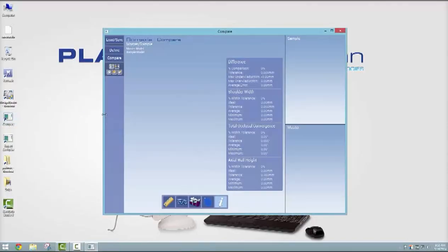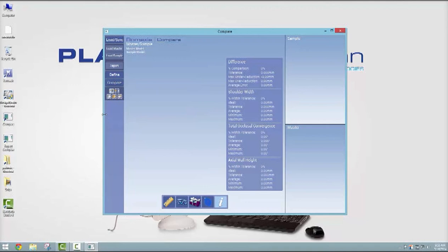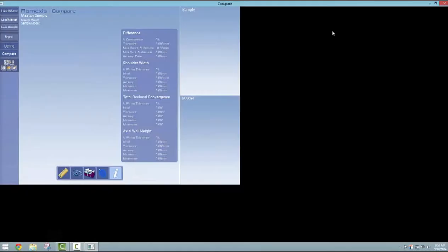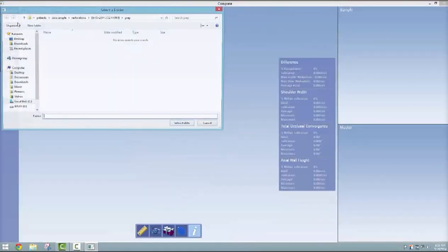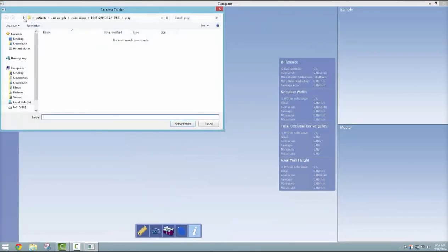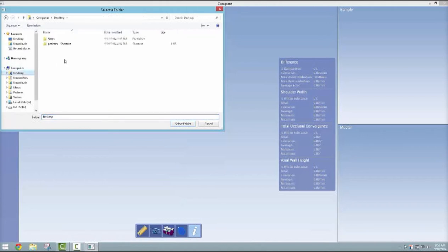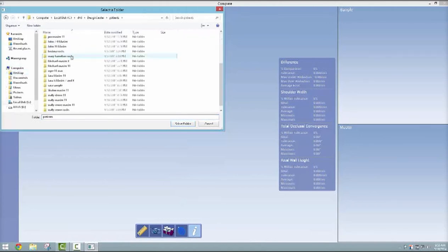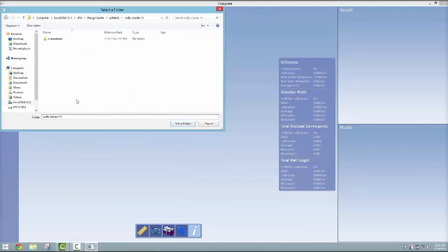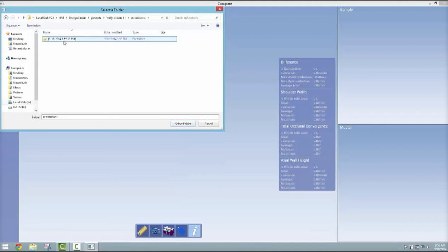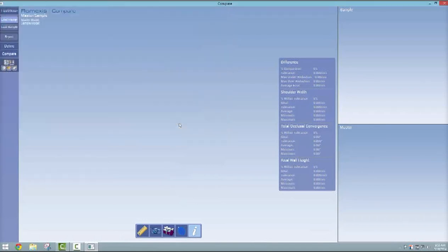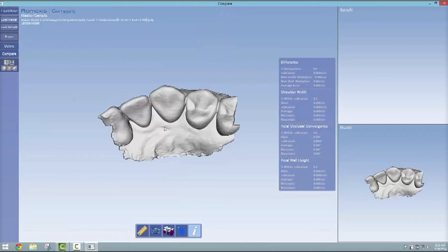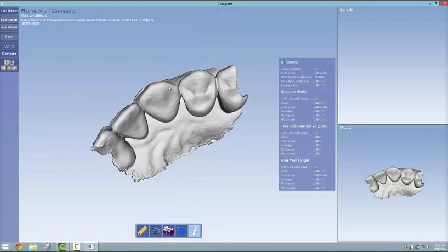Open the compare software and maximize it so you can better see what's going on. You're going to load your master model. It's in a folder on your desktop called Patients. Find the folder that's your name or your masters, and click through the subfolders until you get to the prep folder and select that.